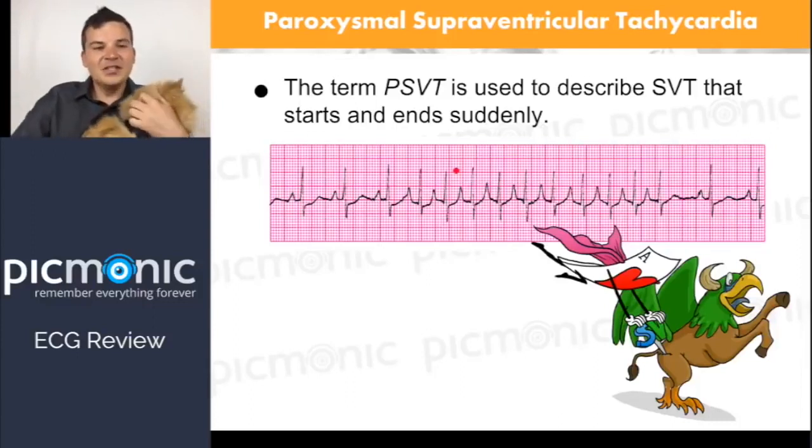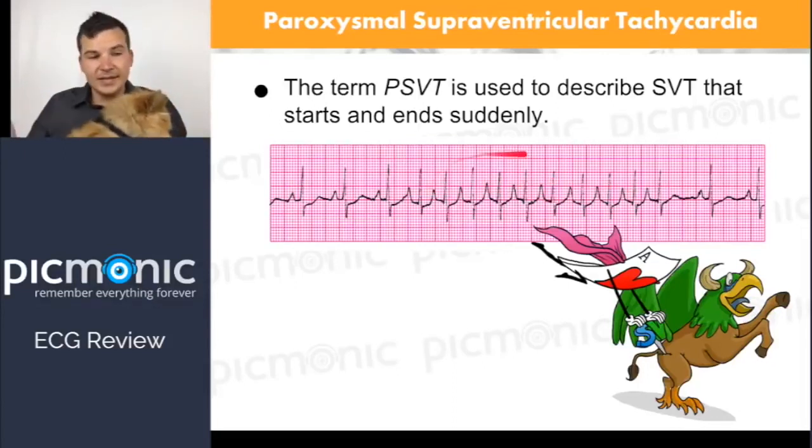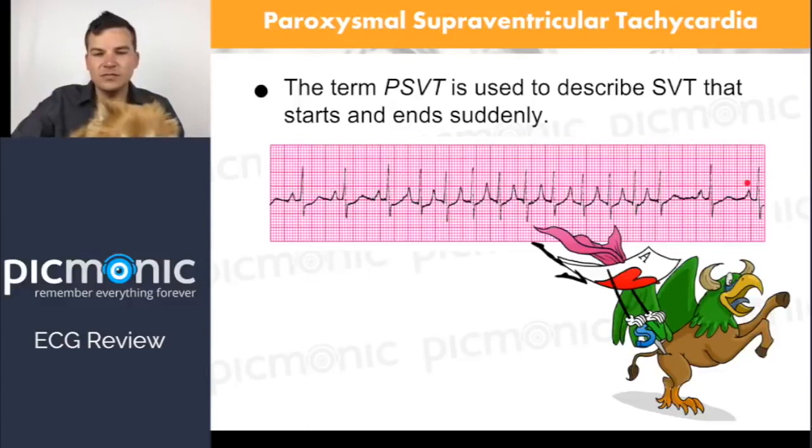He's not happy. So then I have a tiny space, tiny space, tiny space, right across here. That's absolutely right. So it's regular in the middle, but it's too fast. If you just took this section and you multiplied it times two, then you've got a really fast rate, right? But then what happens? Well, then somewhere right along this space, it gets normal again. Here it looks just like the same as it did before. So it was doing something normal, it did some craziness in the middle, and then it just got back to normal again.